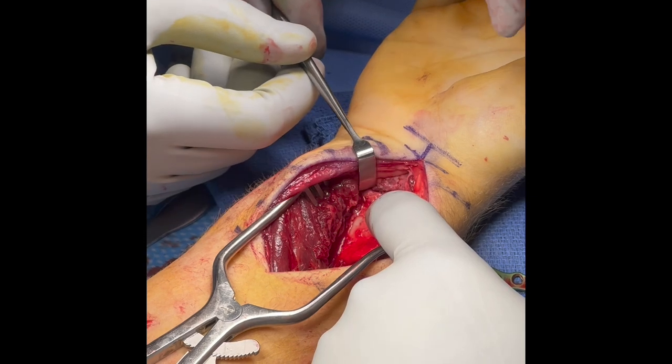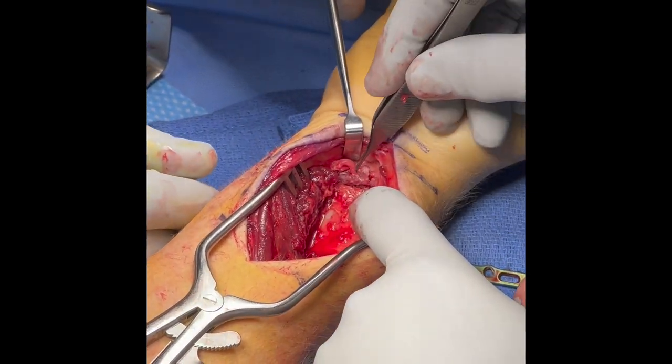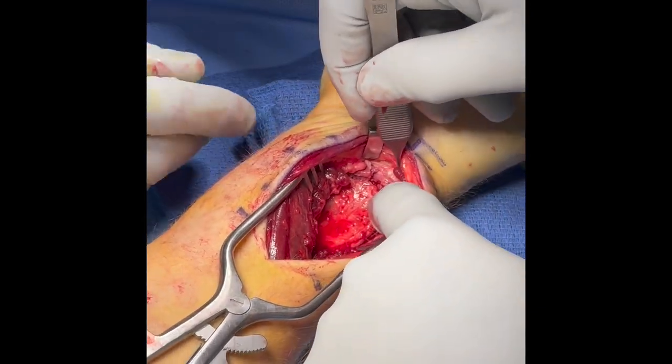Here the lunate facet fragment can be seen, and the radial styloid fragment.